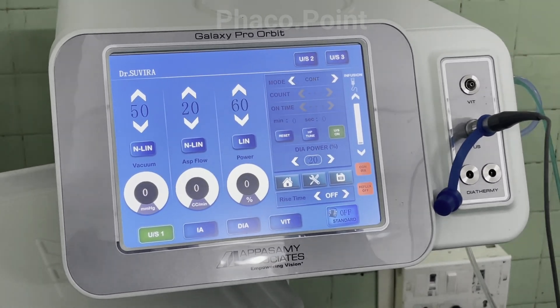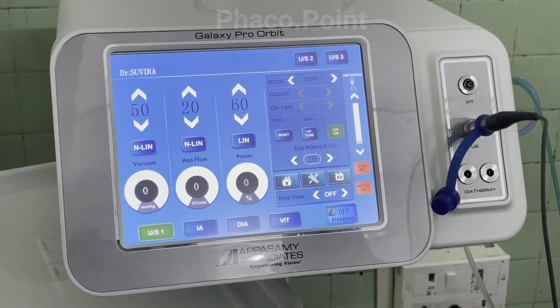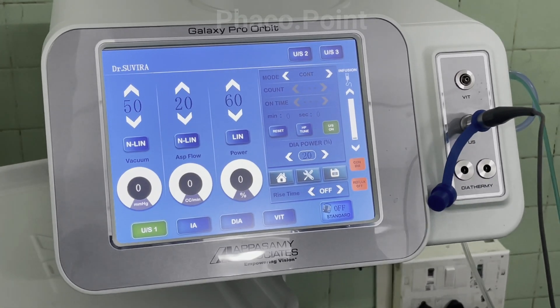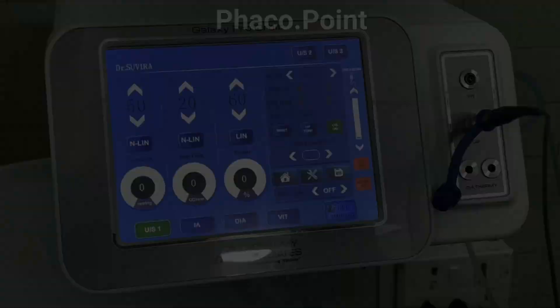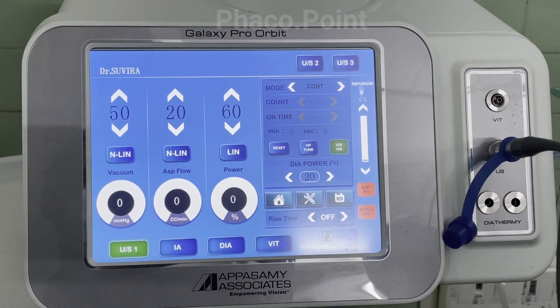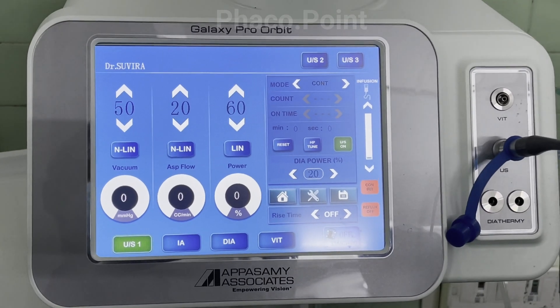Once the priming is complete, your settings show up on the console as the engineer has configured them. At the end of the priming procedure, the settings are ready for your surgery.